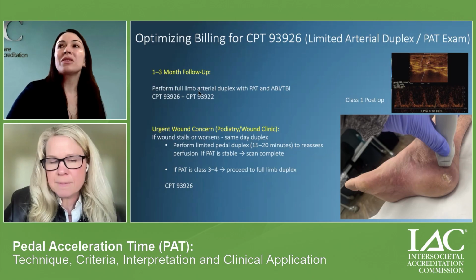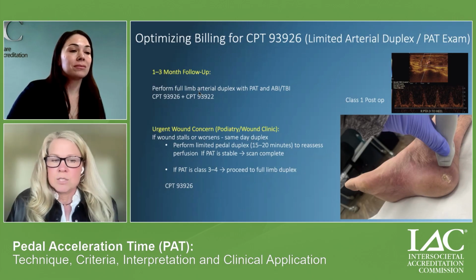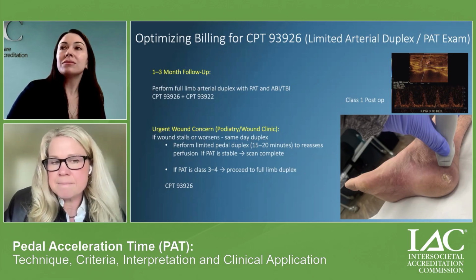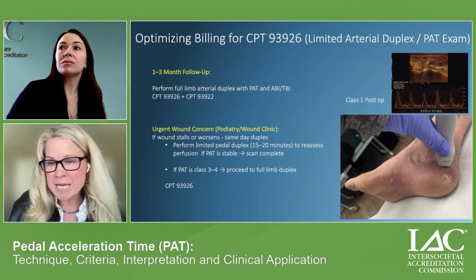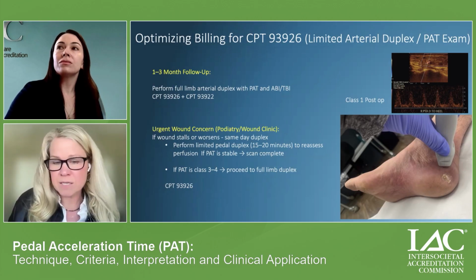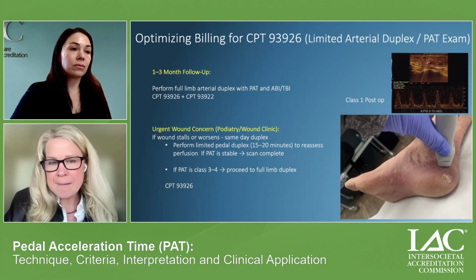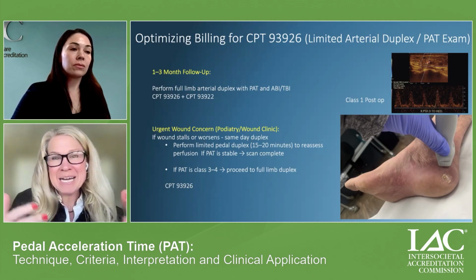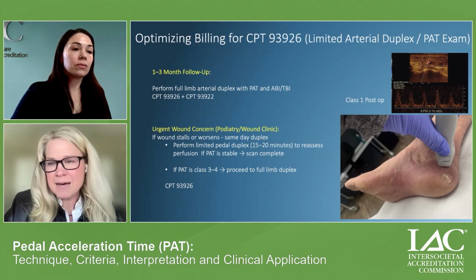Do you need an ABI and TBI when pairing with a PAT duplex? So in this type of setting, it depends on the patient in front of you. And to Marge's point, if this patient is diabetic and you've already done an ABI that was non-compressible, I think it's safe to just continue on with a PAT. I don't want to overstep, Marge, but I think times are evolving, and this is an exciting time, as you said, Marge. Marge, do you have anything to add to that?